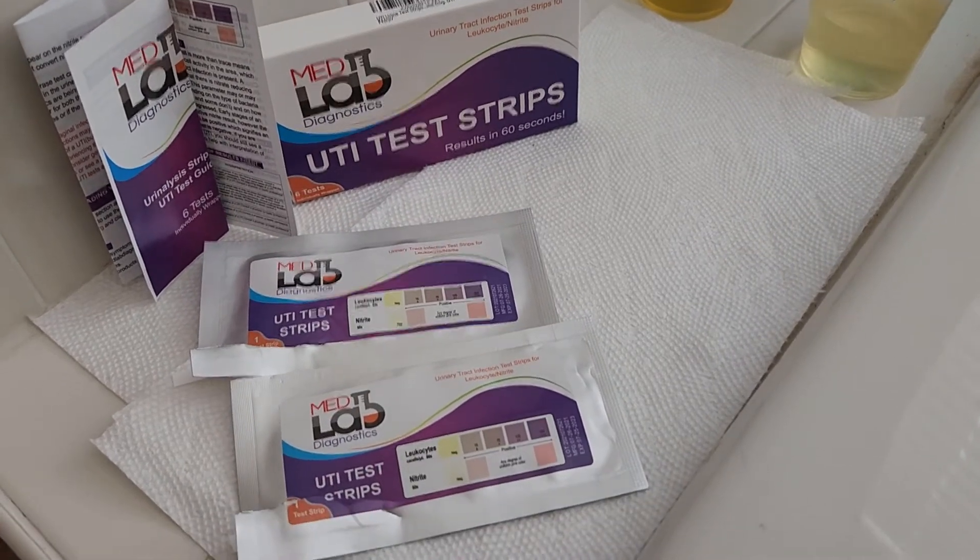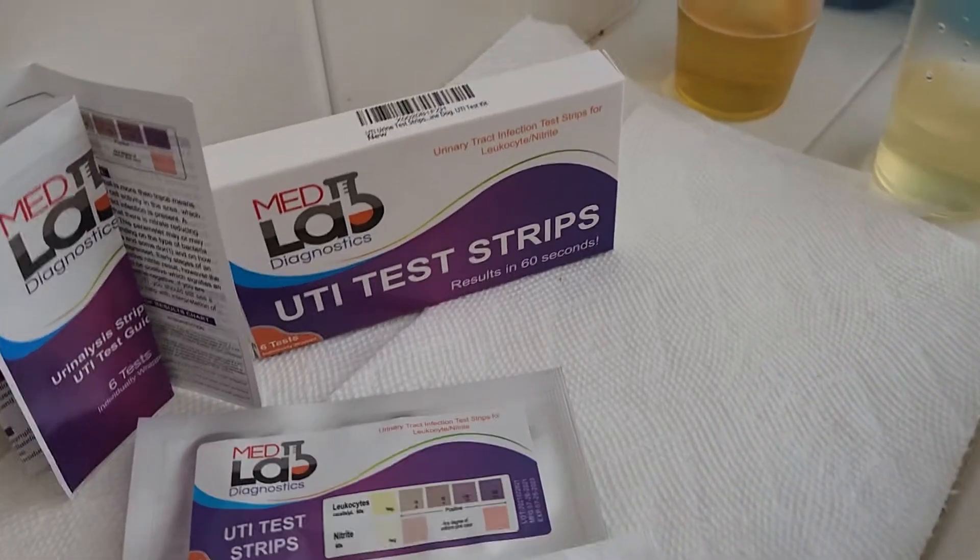Hello, this is Elena with MedLab Diagnostics, and today I'm going to show you how to use our UTI test strips.